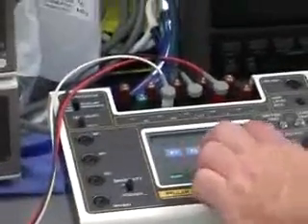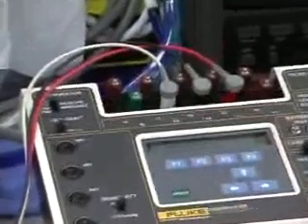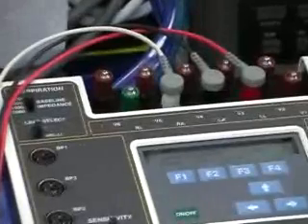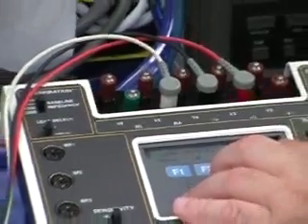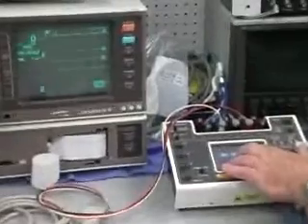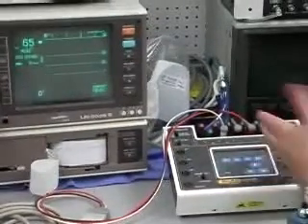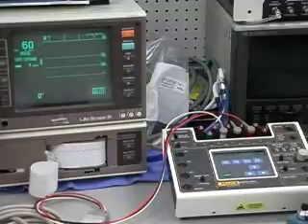But what we can do is hit the auto again. We've got that capability in there, and just wait for it to begin to detect it. It's 12 milliseconds, 20. Okay, now it's just begun picking it up. Okay, at 20 milliseconds, it's working. So that's a good number.